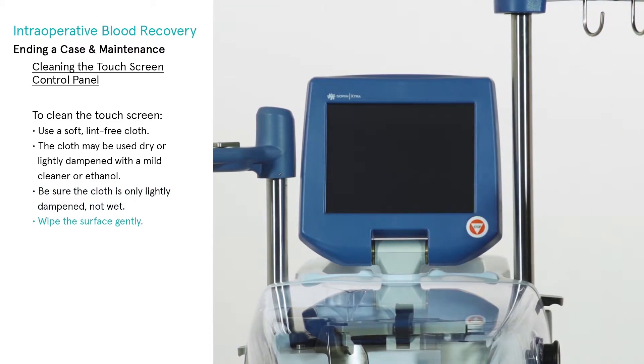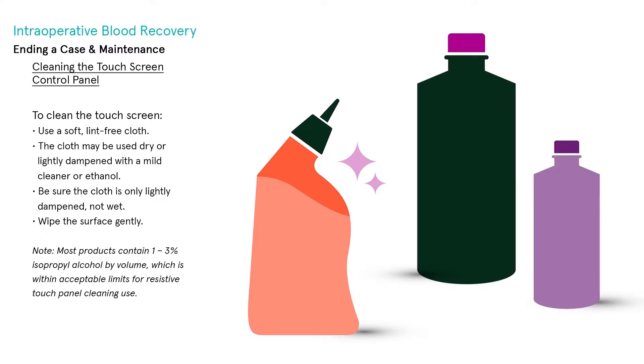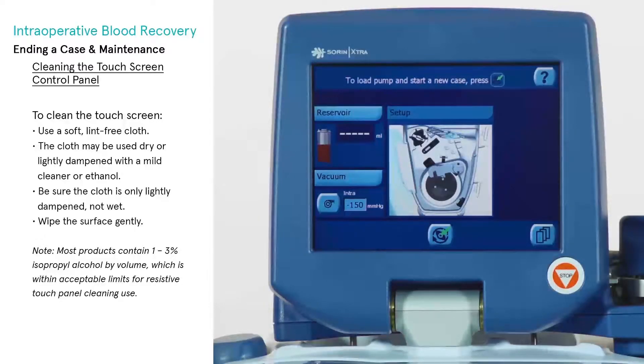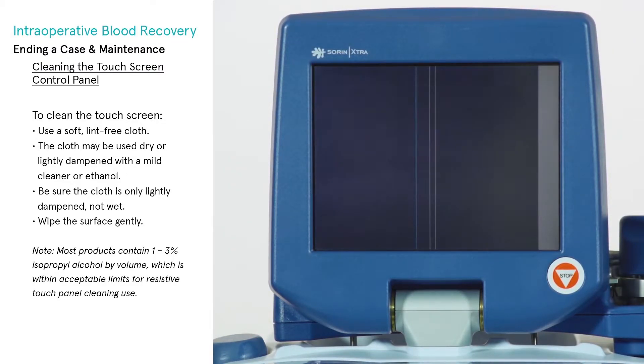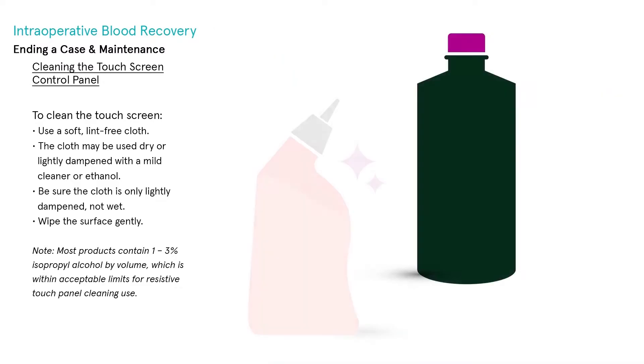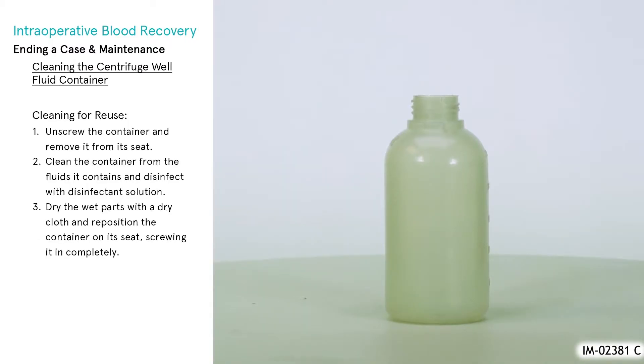Wipe the surface gently. Suitable cleaning products are commercially available and prepackaged for use. Use of incorrect cleaners can result in optical impairment of the touch panel and/or damage to functionality. Note: most products contain one to three percent isopropyl alcohol by volume, which is within acceptable limits for resistive touch panel cleaning.